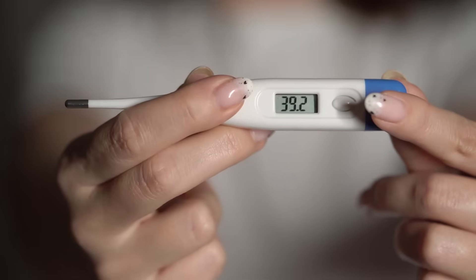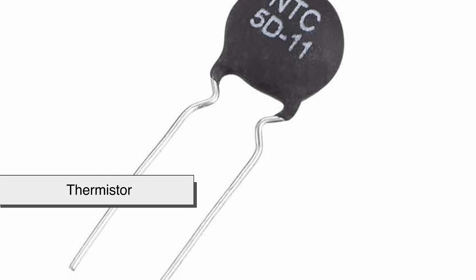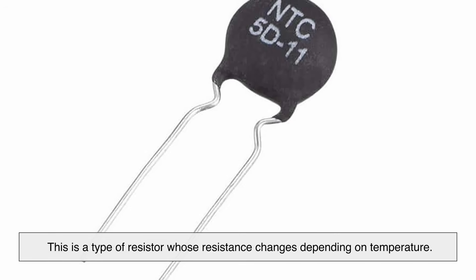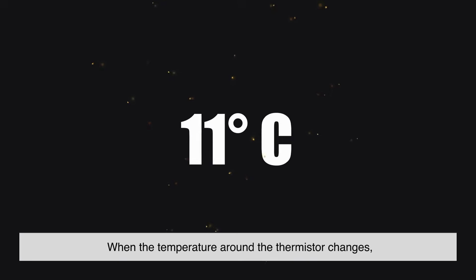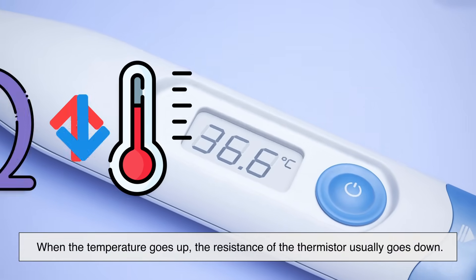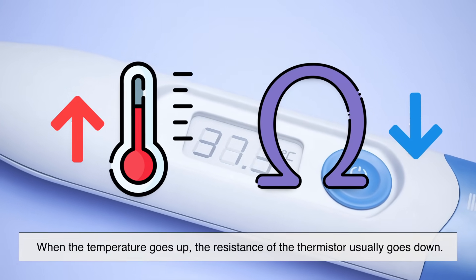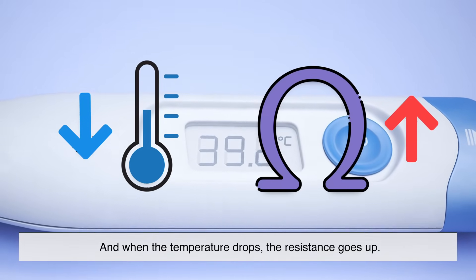At the heart of almost every digital thermometer is a component called a thermistor. This is a type of resistor whose resistance changes depending on temperature. In simpler terms, when the temperature around the thermistor changes, its electrical resistance changes too. When the temperature goes up, the resistance of the thermistor usually goes down. And when the temperature drops, the resistance goes up.